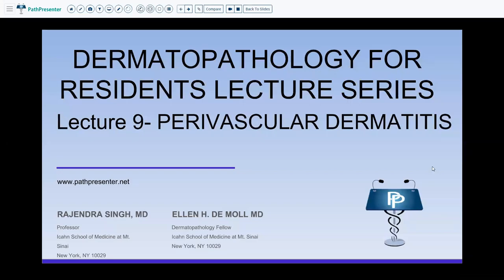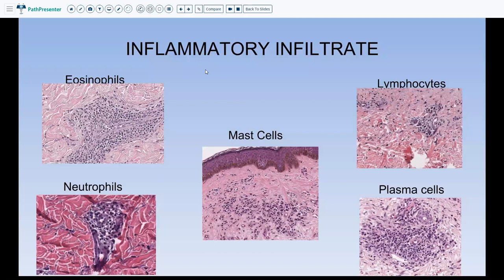Today, continuing the Dermatopathology for Residents series, we are on lecture number 9: Perivascular Dermatitis. When you talk about perivascular dermatitis, the first thing to think of is what kind of inflammation you see in the dermis. You will usually see a lot of lymphocytes, but you need to go high power and determine if it is purely lymphocytes or if there are admixed eosinophils, predominantly neutrophils, mast cells, or plasma cells. Based on that, you can narrow down your differential diagnosis.